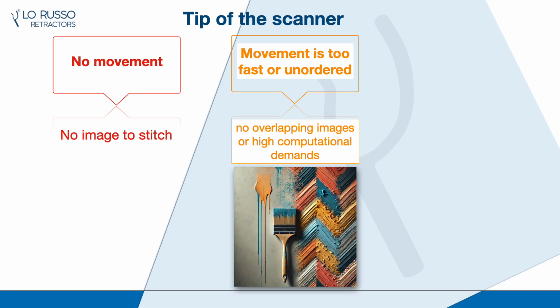Conversely, erratic or excessively rapid movements create a chaotic influx. This places an unsustainable computational demand on the software, often leading to lost positions or significant dimensional inaccuracies. In edentulous cases, unordered movement is the primary source of digital artifacts.